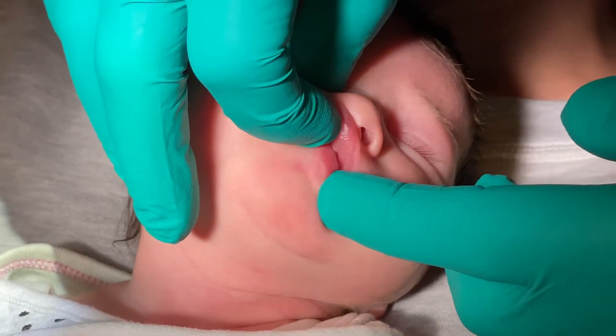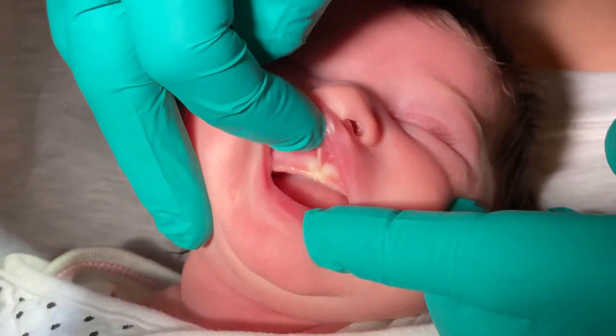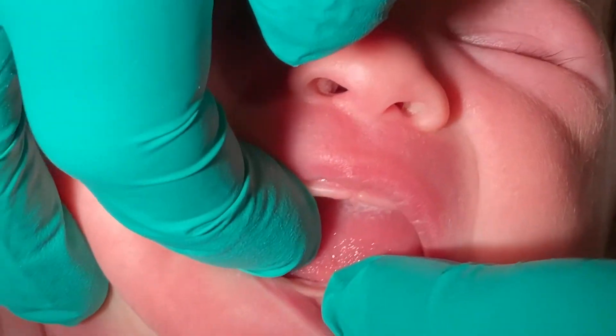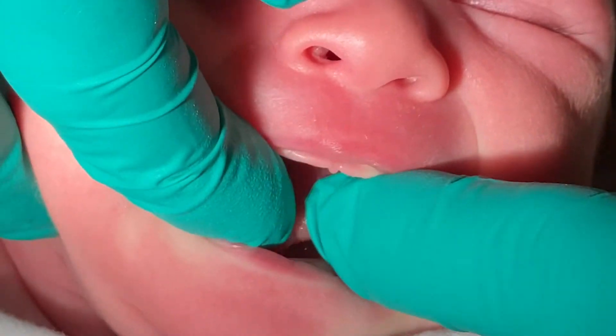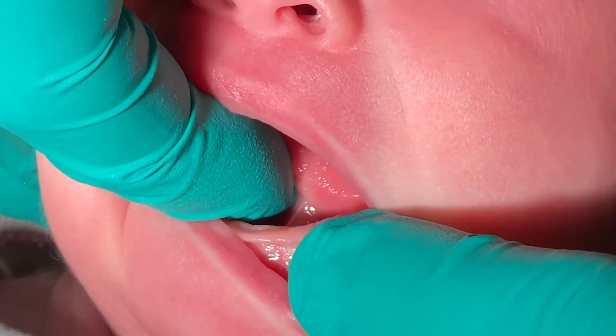I'm going to show you real quick just what the maxillary looks like — you can see how tight that is. The baby is not nursing very well. The lingual is also affected, and when I get my finger in there you'll be able to see that the tongue is totally tied.